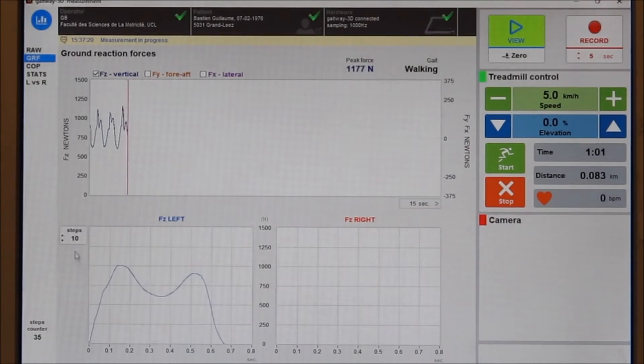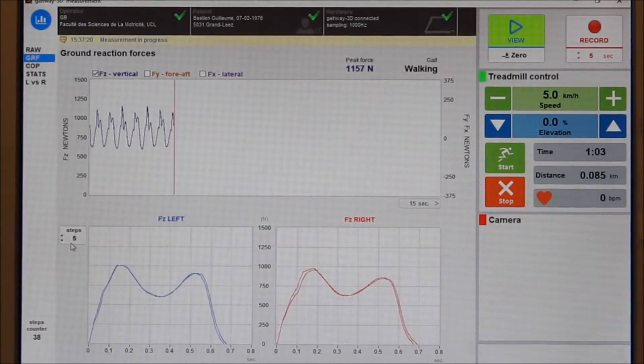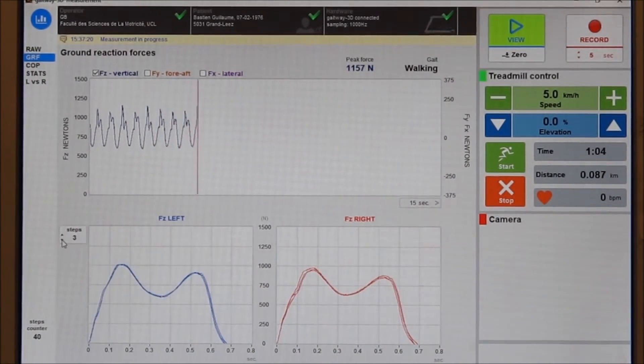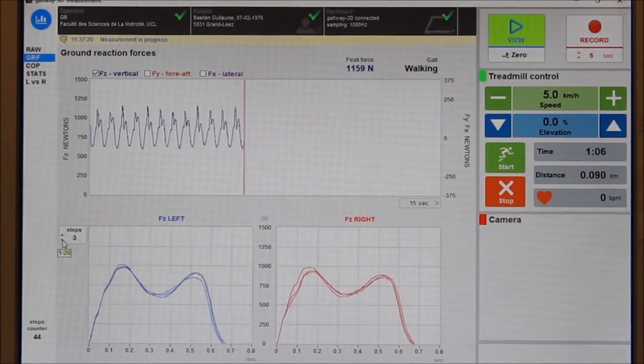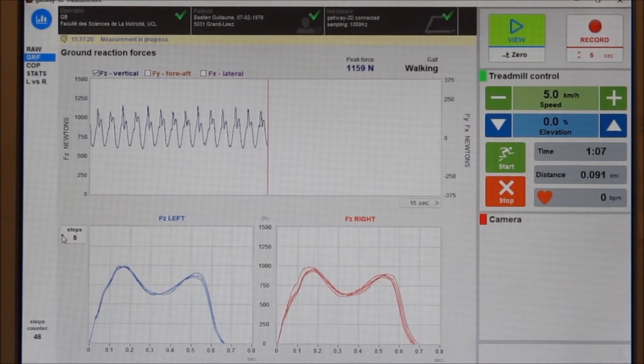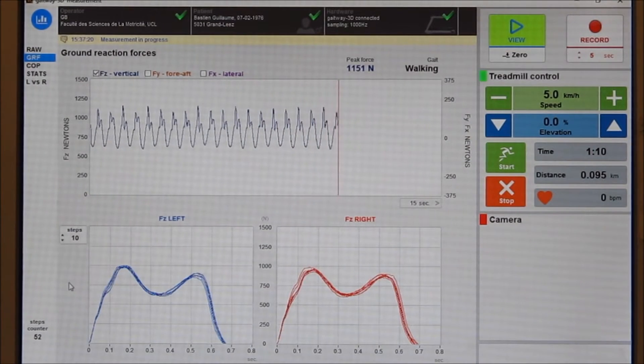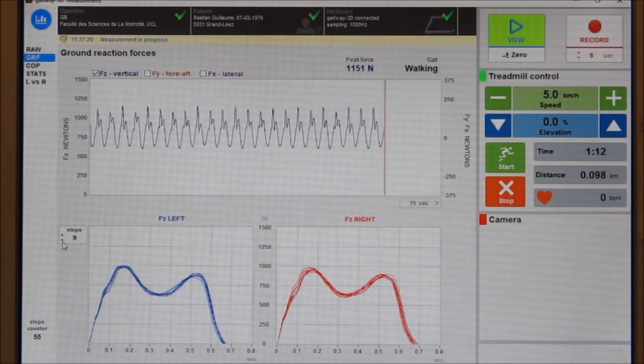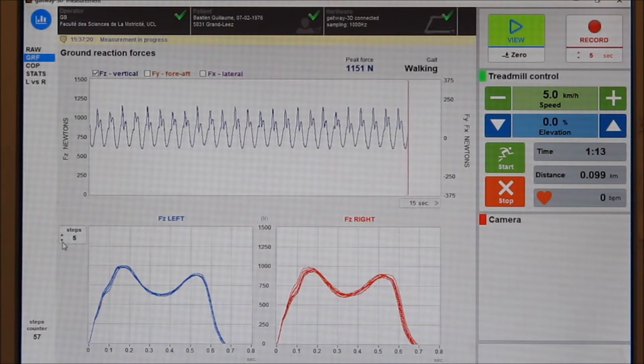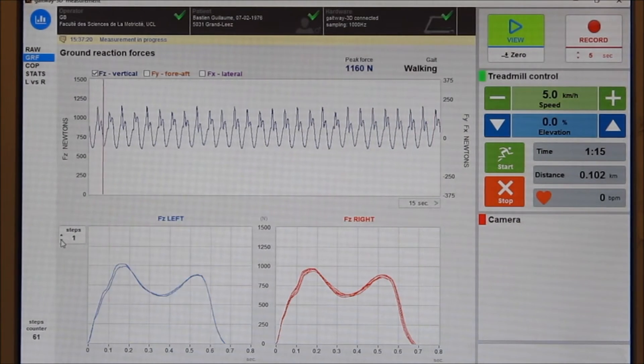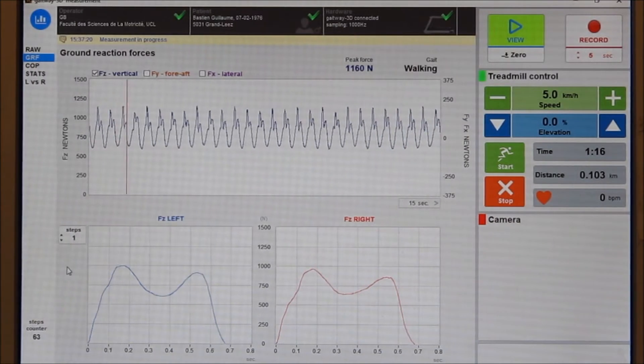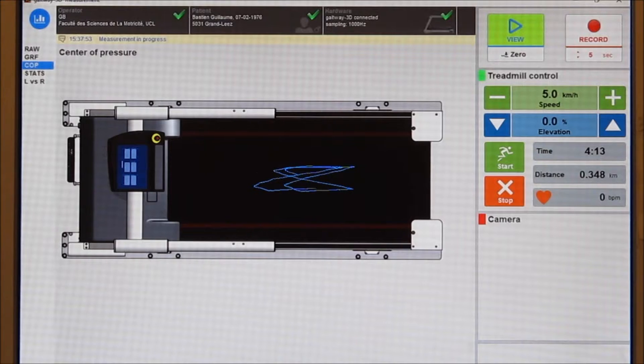During the double contact period of walking, an algorithm is used to separate the vertical force under each foot. The algorithm has been published in Gait and Posture in 2015. It has been validated in 115 subjects including normal and pathological gaits.